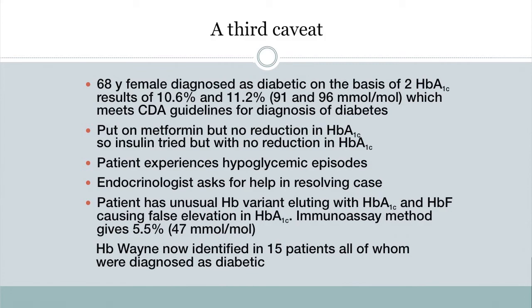What we found was that this individual had an unusual hemoglobin variant that co-eluted with hemoglobin A1c and hemoglobin F, causing a false elevation in the hemoglobin A1c result. The immunoassay method gave a result of 5.5, but that's not a true answer either. We identified this hemoglobin variant as hemoglobin Wayne, and have since identified it in 15 individuals, all related to this original case.